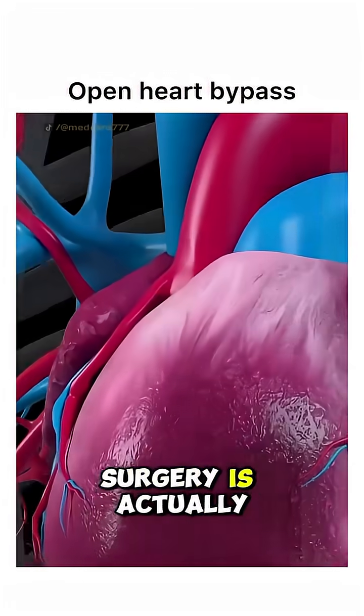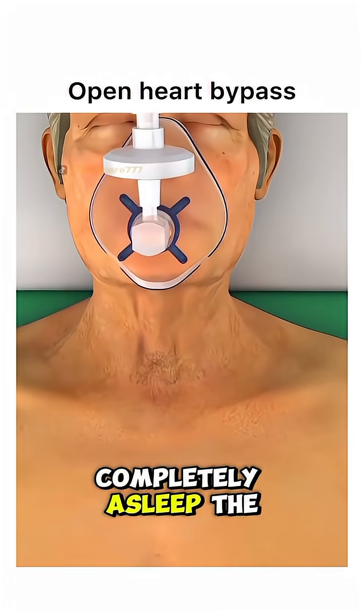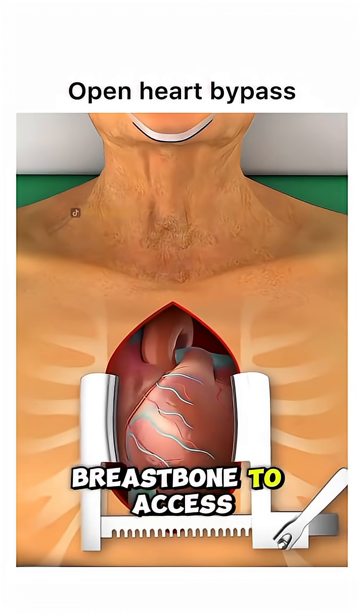Ever wondered how open-heart bypass surgery is actually performed? It begins with the patient under general anesthesia, completely asleep. The surgeon makes an incision down the center of the chest and splits the breastbone to access the heart.